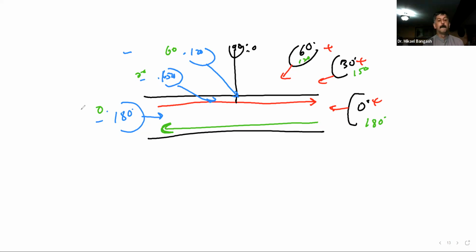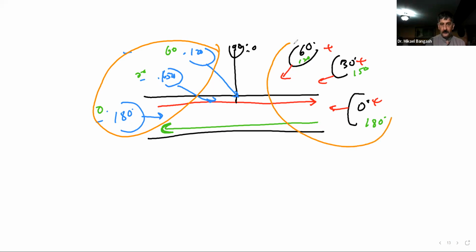Right? Because now, if you say that the blood is flowing in the direction of the light green, and this is where we are scanning from, the blood flows towards us. Whereas we have been scanning from over here, at any of these angles, the blood will flow away from us. Did you ladies get that?